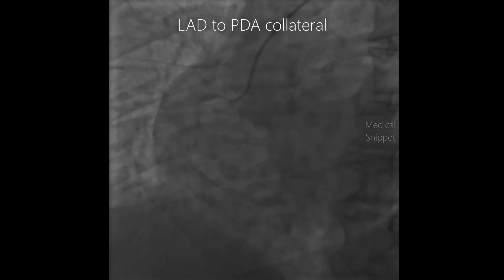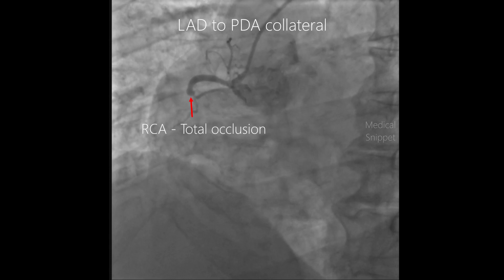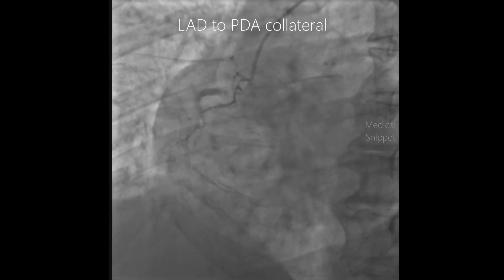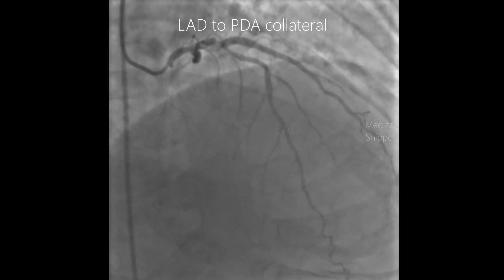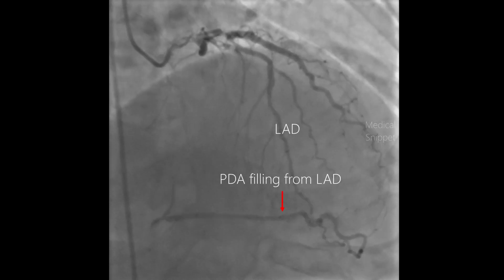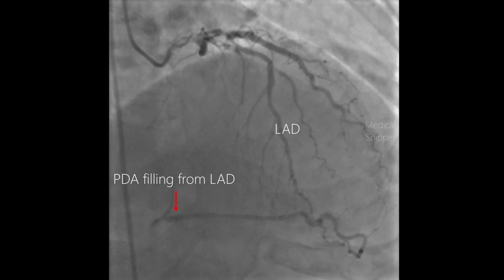The third case is collateral circulation from the left anterior descending artery to the posterior descending artery. In this angio shot, there is total occlusion of the right coronary artery, and the posterior descending artery is being filled from the left anterior descending artery.